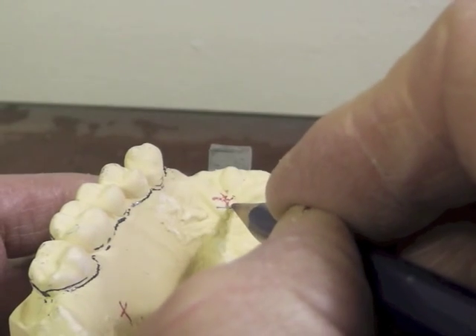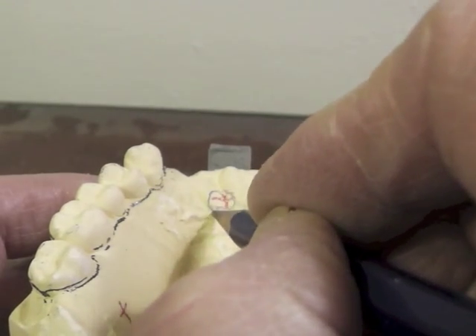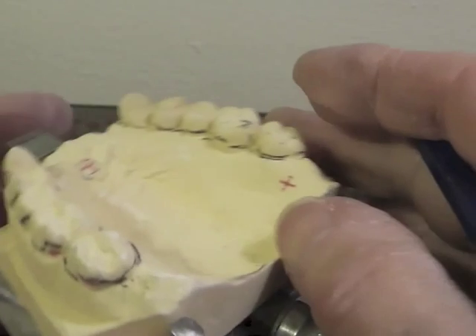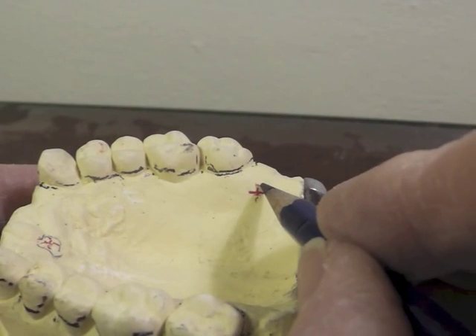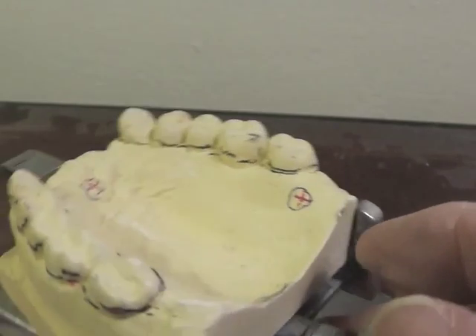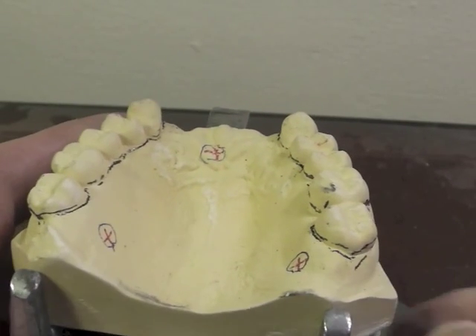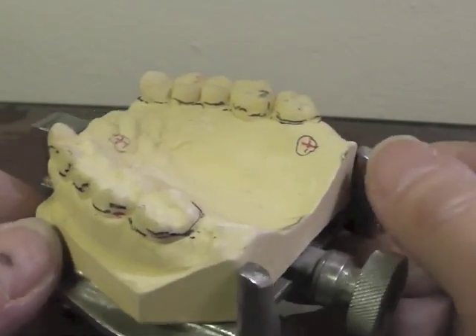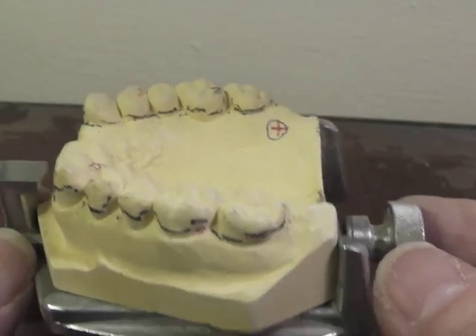That way the technician has the cast in exactly the same orientation as you do, so when he's working on it he'll have it in the exact same position. Then with the blue pencil — that bomb sight, as some people affectionately call it — by doing the marks in red and blue, if you get a lot of extraneous lead marks on your cast, you'll have no difficulty identifying where the true marks were.